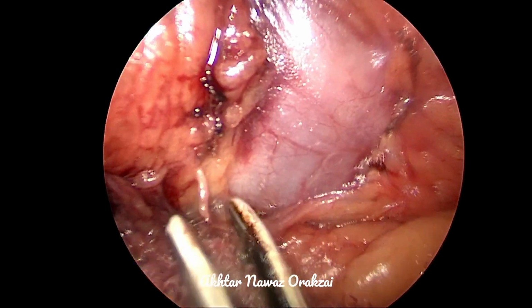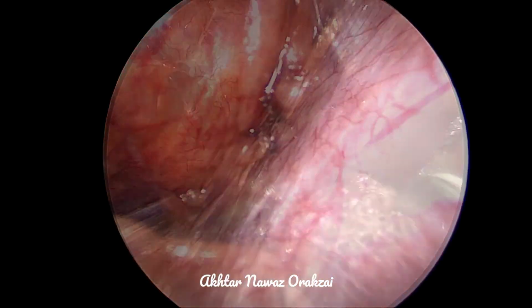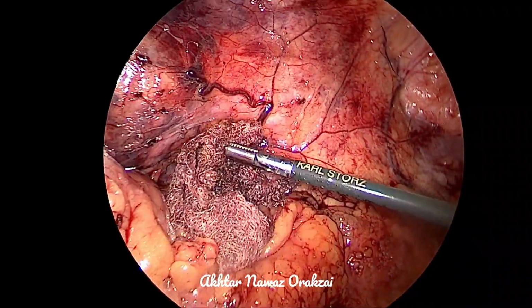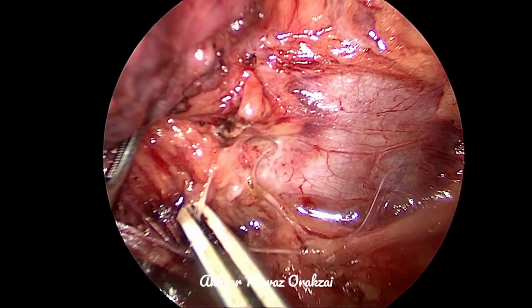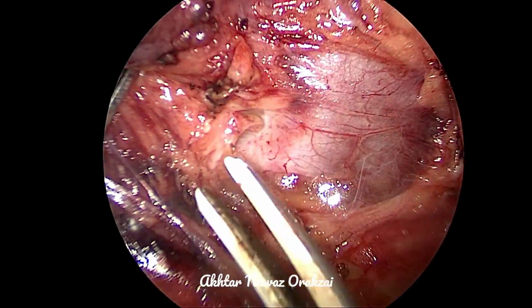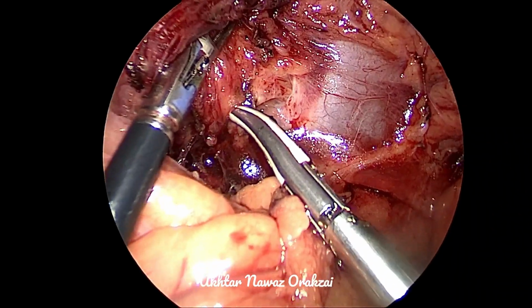As we all know, manipulation of the gland can lead to acute surge of catecholamines, leading to cardiovascular responses. So we place another port in the left iliac fossa for the assistants who can hold the medialized portion of the gut away from us, so that we can dissect the adrenal vein.